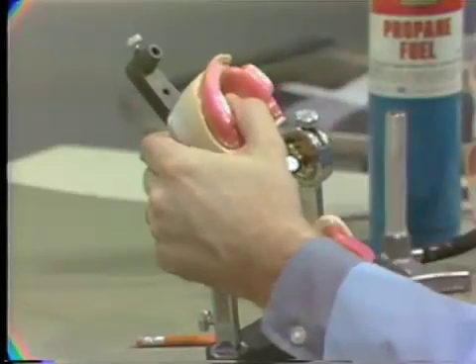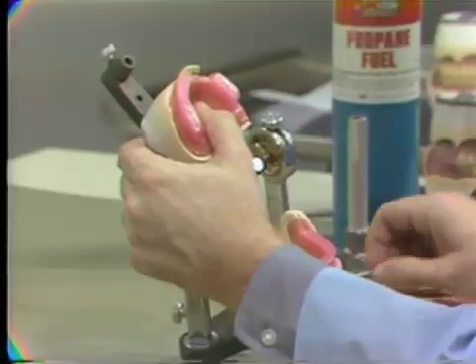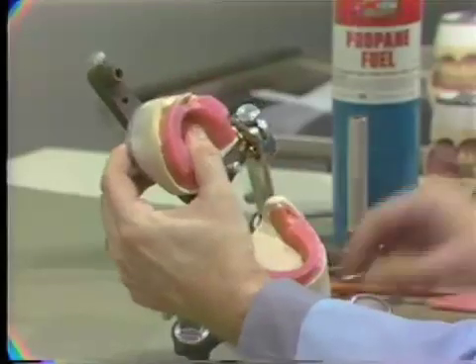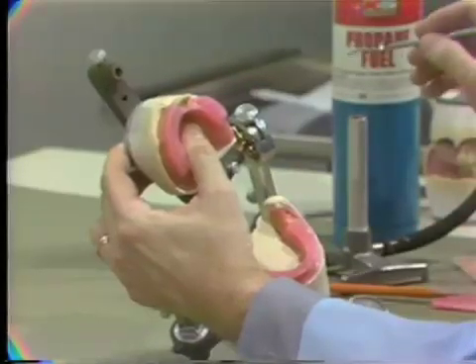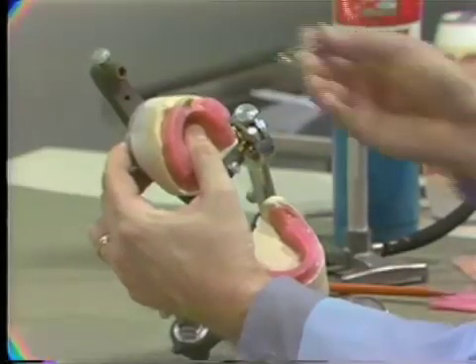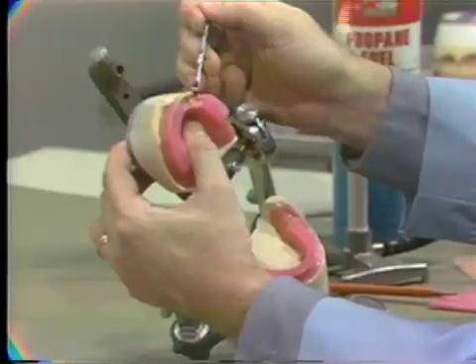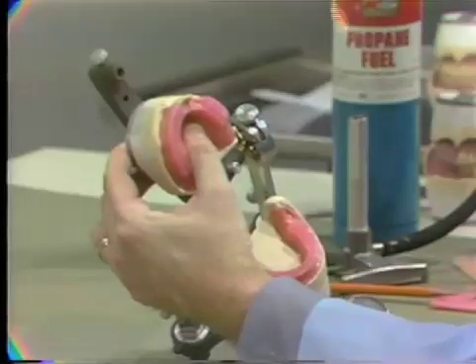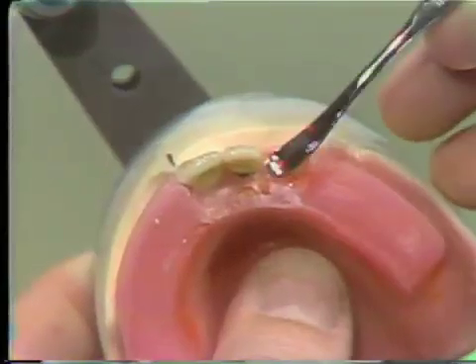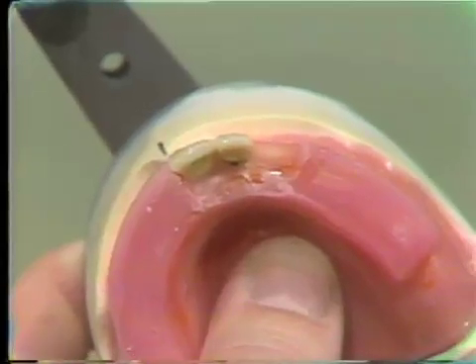Now the third tooth, of course, is the cuspid. And the characteristics of the cuspid in setting teeth for the denture are that the incisal edge, again, like the central, is placed to be 1 millimeter below the occlusal plane. The second characteristic of the cuspid is that the neck is prominent and leans slightly toward the distal. Now this supports the corners of the lip and is a very important tooth. When people lose cuspids, it usually makes a difference aesthetically. So the cuspid tooth on a denture is a very important tooth.